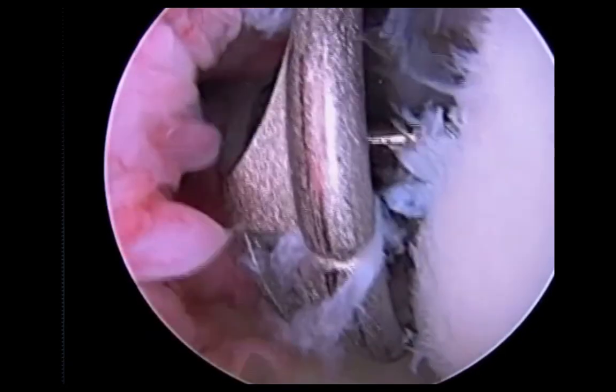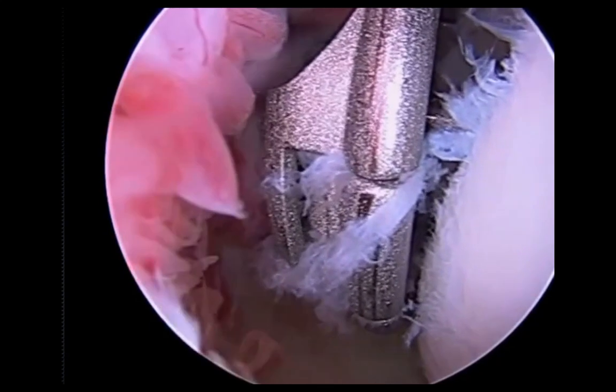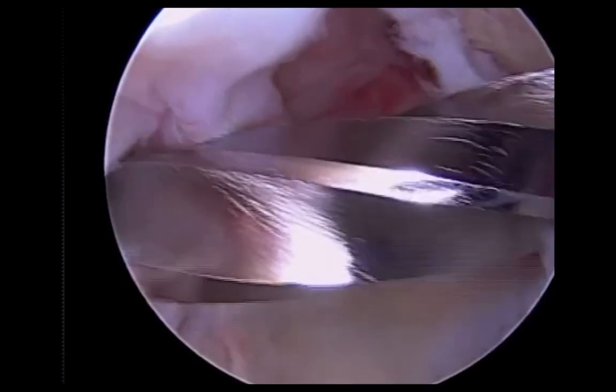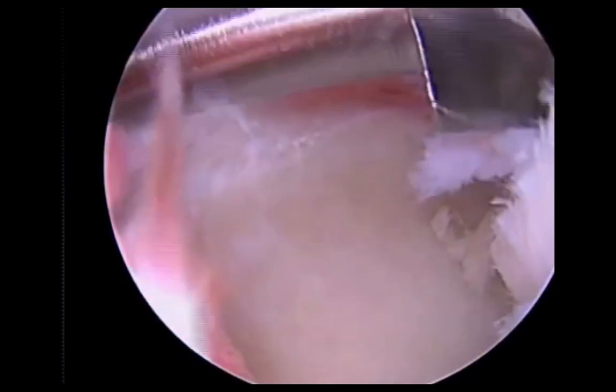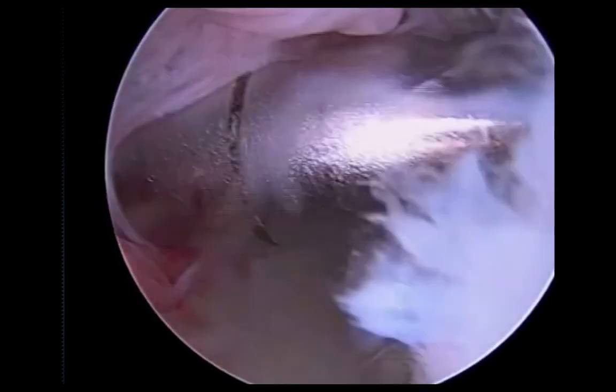We position the HemiCAP sizer in the mid portion of the defect. If we're doing 2 HemiCAP implants, we do the inferior one first. This prevents our view being obscured by having a superior cap in place. We then drill before tapping to the appropriate depth.